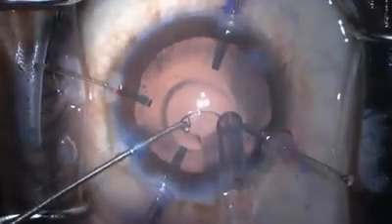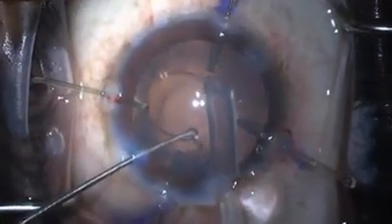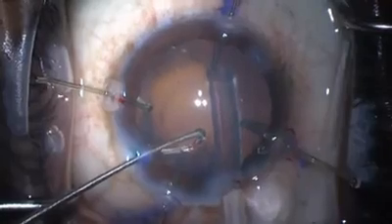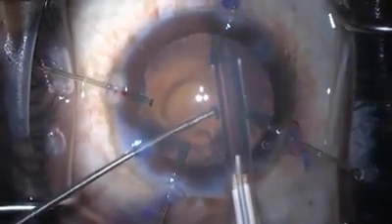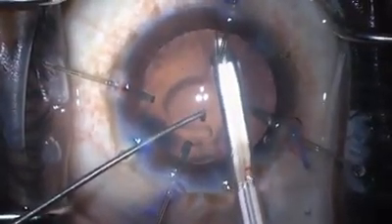We're going to use this technique that we learned from Dan Bettis here at the University of Iowa, and that's to use a Sinskey hook to guide the leading haptic around so that there's very little trauma, and most importantly here, so that the capsular tension ring doesn't inadvertently go through one of those retractors. You see what a wonderful job he did. This is a little bit tricky using both hands like this.